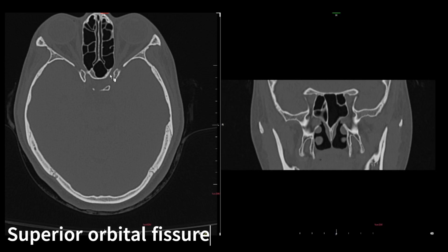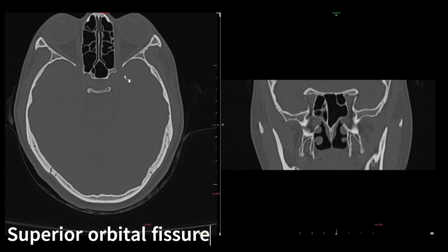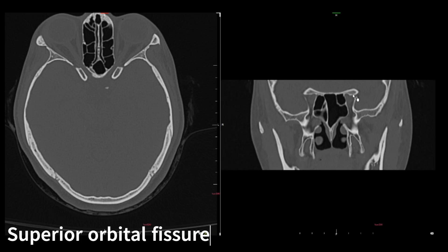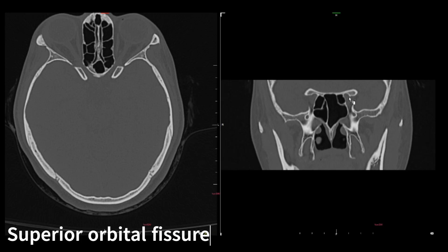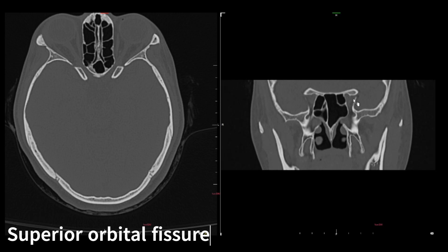Next we have the superior orbital fissure. The optic canal is here, and you can see another foramen nearby. The greater wing of sphenoid and the anterior clinoid process of the lesser wing of sphenoid form the borders — between those two bones you have the superior orbital fissure. On coronal, this is the superior orbital fissure and that was the optic canal adjacent to it.